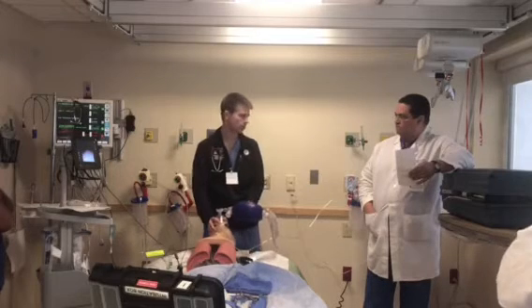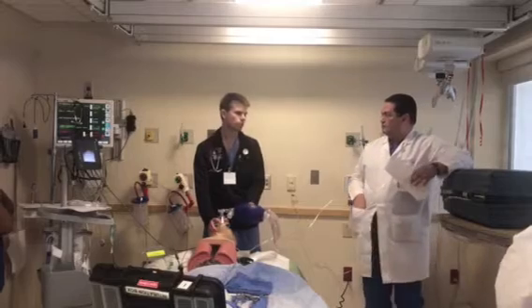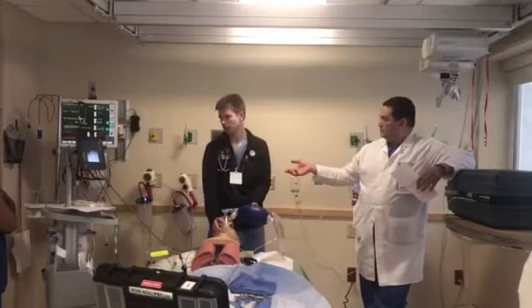But this is a whole totally new scenario. We didn't do any of the previous stuff. So it's more emergent. We barely got the patient up to 88%, so we just need to go ahead and try the intubation. Let's use the glide scope.